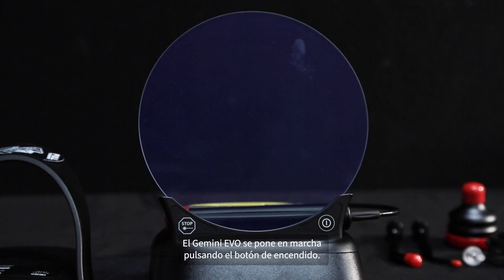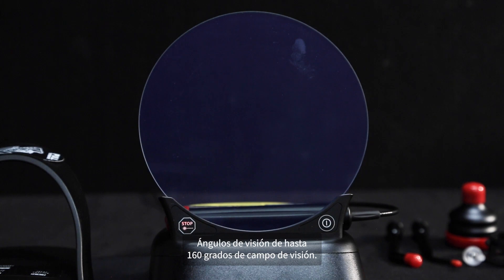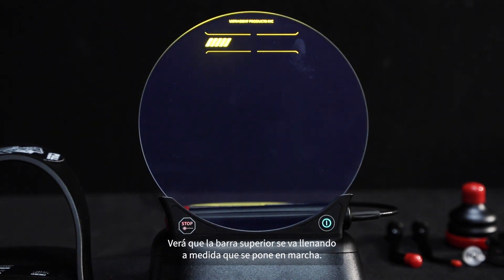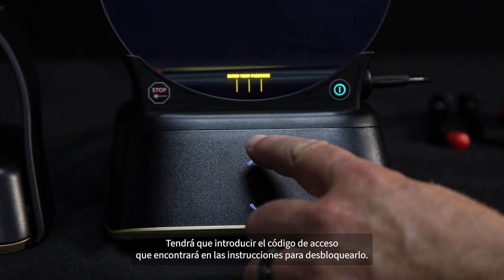The Gemini Evo starts up by pressing the power button. It is designed with a transparent electroluminescent display that can provide high resolution viewing angles from up to 160 degrees of field of view. You will see the top bar fill as it starts up, and you will have to enter the passcode found in the instructions to unlock it.